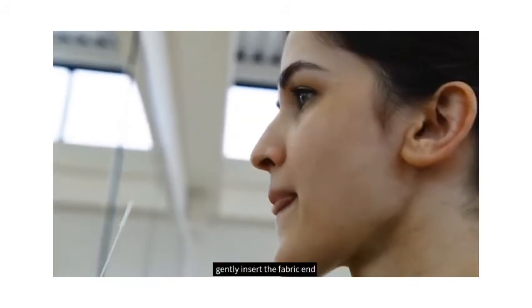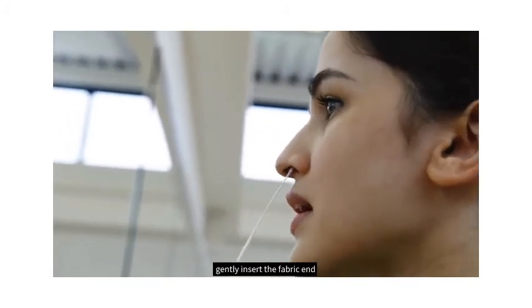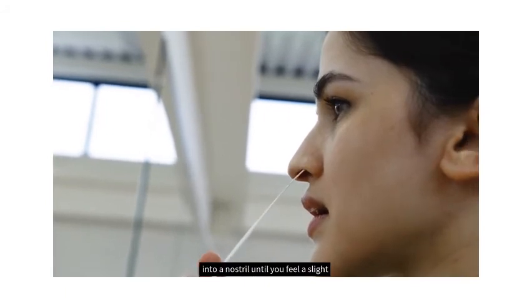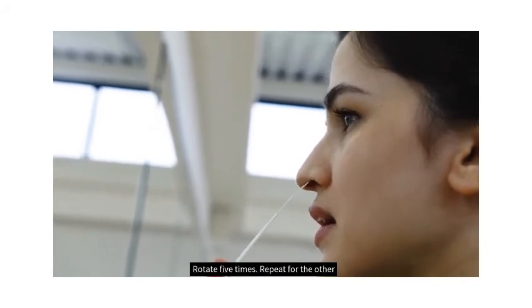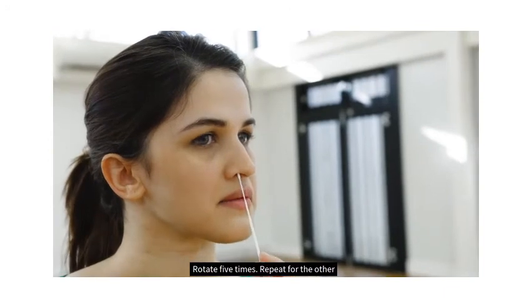Use the same swab. Gently insert the fabric end into a nostril until you feel a slight resistance. Rotate five times. Repeat for the other nostril.